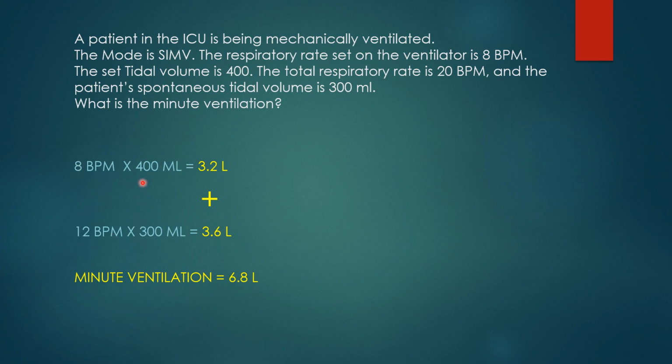spontaneous breaths. Here's his mandatory breaths, and here's his spontaneous breaths. So we add those two together, and we get 6.8 liters. This patient's minute ventilation is 6.8 liters.